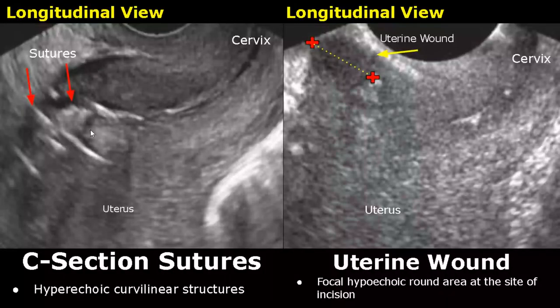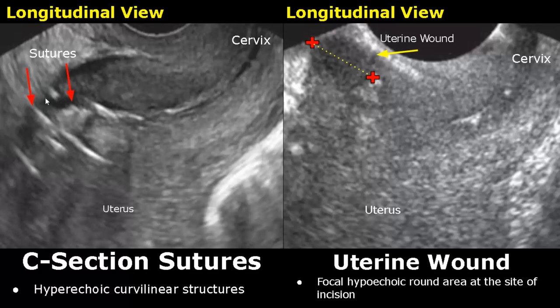These are longitudinal transvaginal images of the uterus after a caesarean section. These curvilinear hyperechoic structures are the sutures, and over here this is a uterine wound. It appears as a focal hypoechoic area at the site of the incision. These appearances are normal after a C-section.